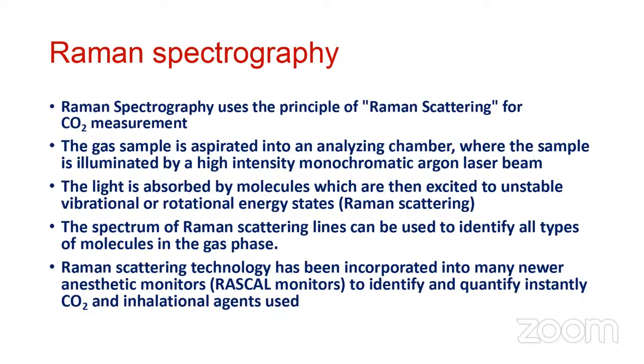Raman spectrography uses the principle of Raman scattering for the CO2 measurement. Here, the gas sample is aspirated into an analyzing chamber, where the sample is illuminated by a high intensity monochromatic argon laser beam. And then the light is absorbed by the molecules, which are then excited to unstable vibration and rotational energy states. That is Raman scattering.